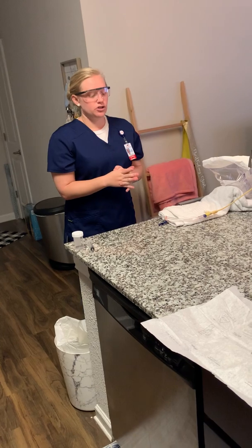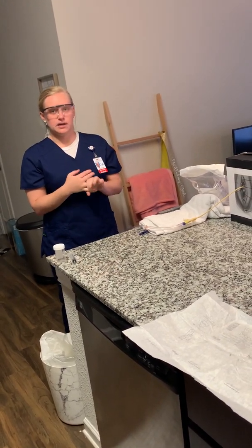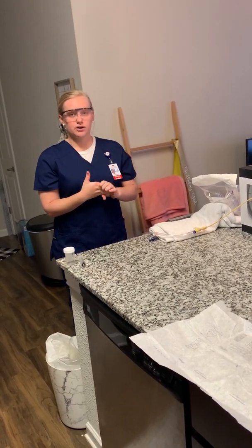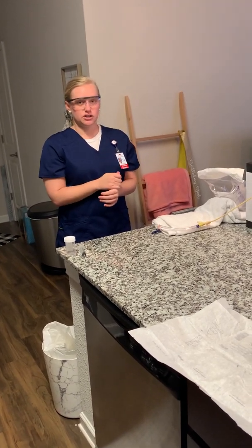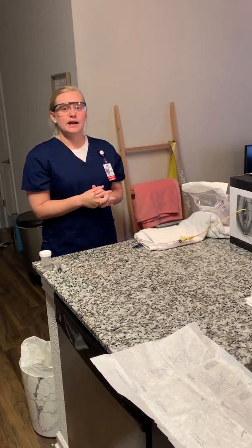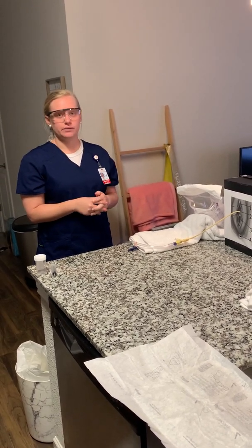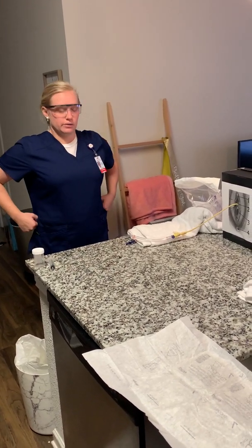So now I want to document. I'm going to document the catheter size, the amount of urine, the color of the urine, the consistency of the urine, how the patient tolerated the procedure, and the specimen collection. I also want to note that I would clean the catheter daily and after there's an incontinence of stool, and that I would remove the catheter when medically indicated. So now I'm going to show you how to remove the catheter.